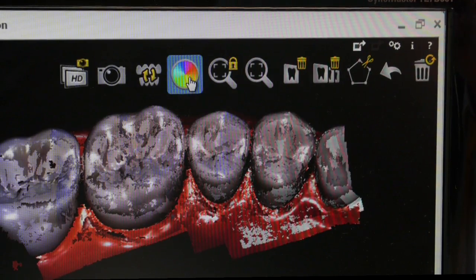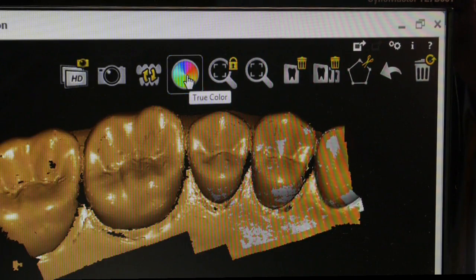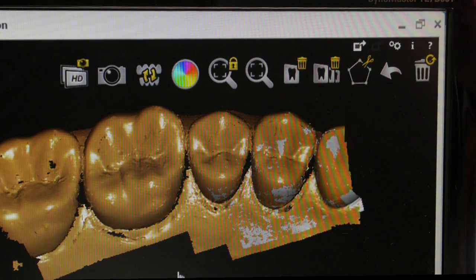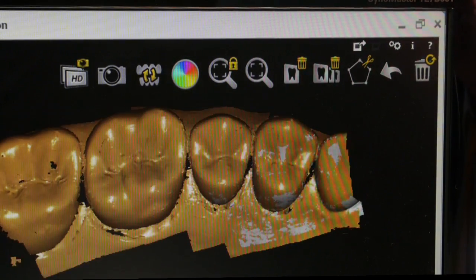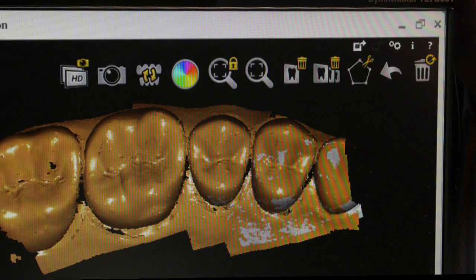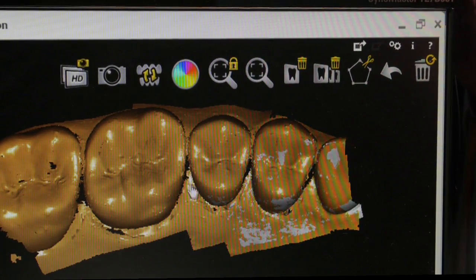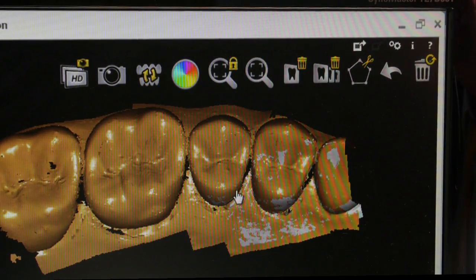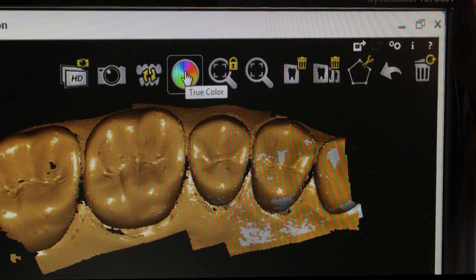This next button changes true color into monochrome. That may be of benefit to see margins — it's sometimes easier to see a margin in one color and you can see these defined lines clearer, but you have the option.